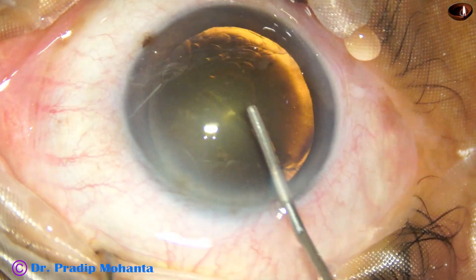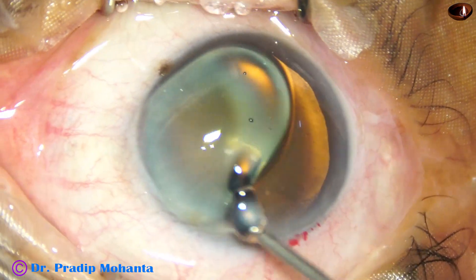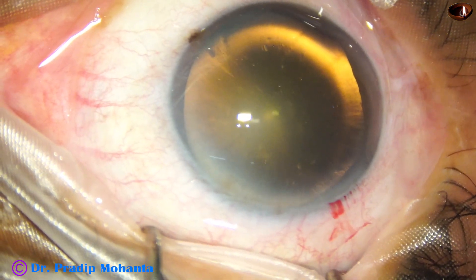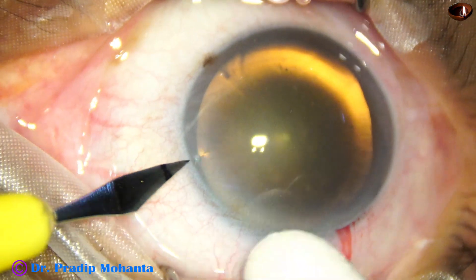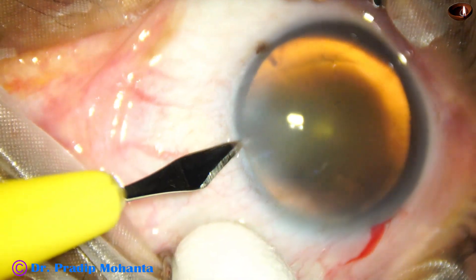So I have made the main incision. Now this is visco filling up the anterior chamber. This is 2% hydroxypropyl methylcellulose. Methylcellulose has been applied over the cornea also, and now a side port is made on the left side of the main incision about three clock hours away.